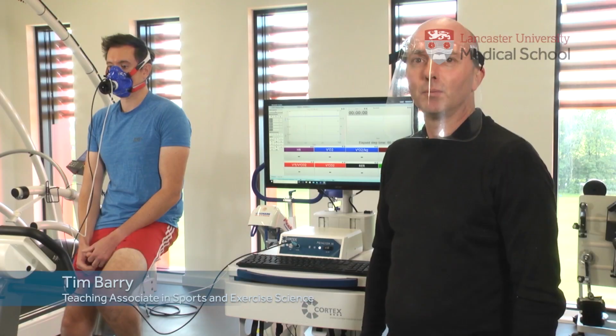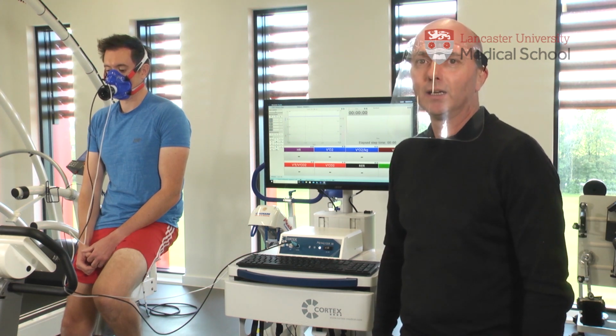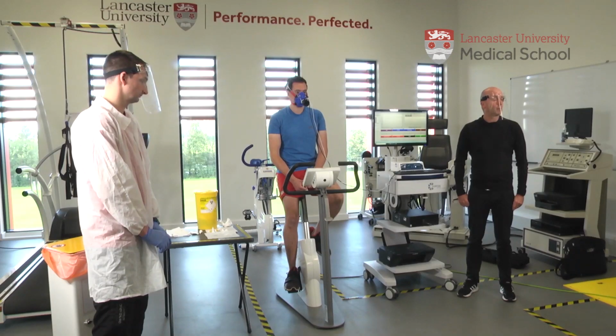Welcome to Lancaster Human Performance Lab. Today we're going to look at the lactate threshold test. We've got Dr. Chris Gaffney on the bike and we've got Jack Cunningham taking the blood.